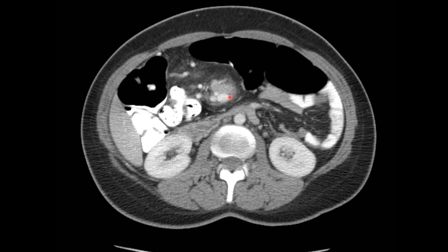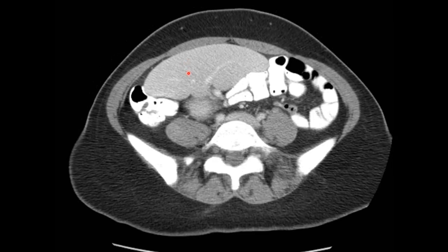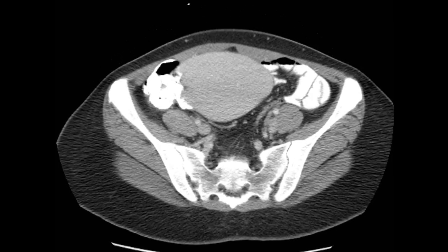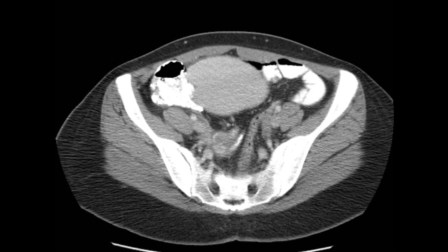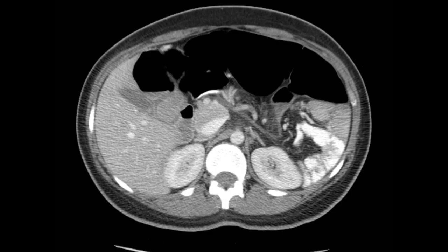As we move inferiorly, there's this vascular pedicle extending to the spleen here in the lower abdomen and upper pelvis — it's just above the uterus and the ovaries. The spleen and the uterus don't normally hang out together, so this is abnormal.